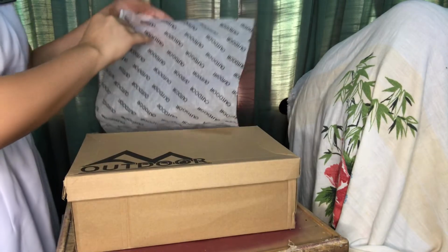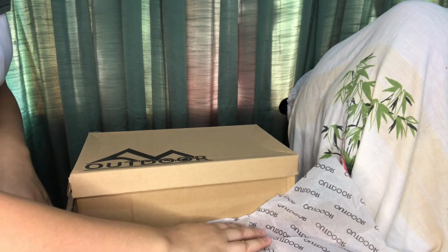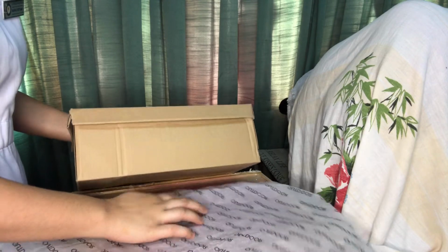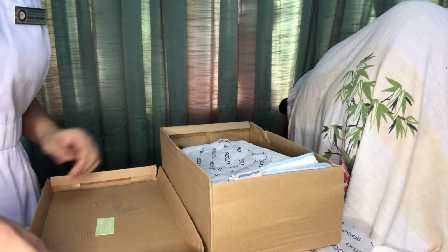Open the catheter tray using aseptic technique. Place the waste receptacle in an accessible area. I have my waste receptacle or trash bin at the bottom part, and assuming that the table is also clean, this is my catheter tray.